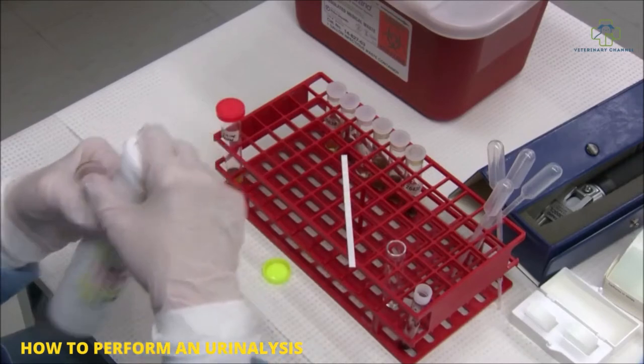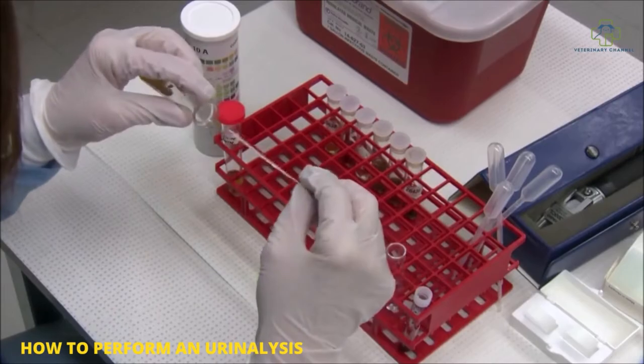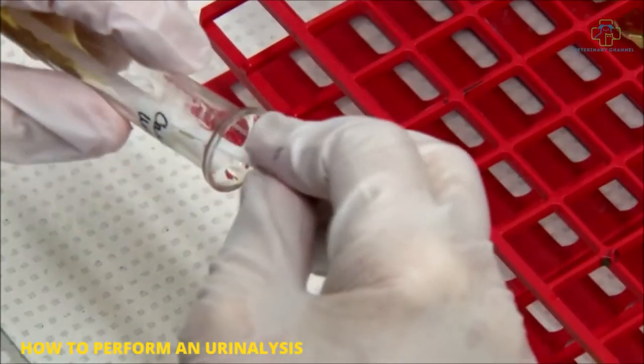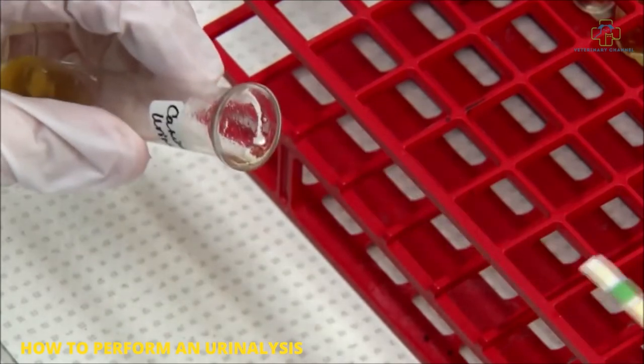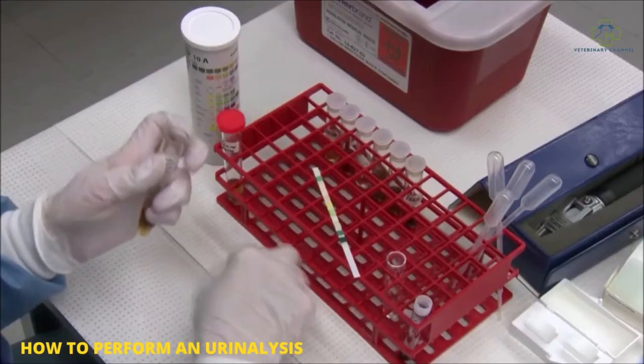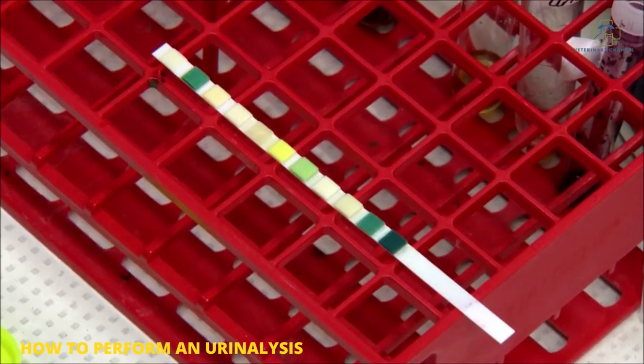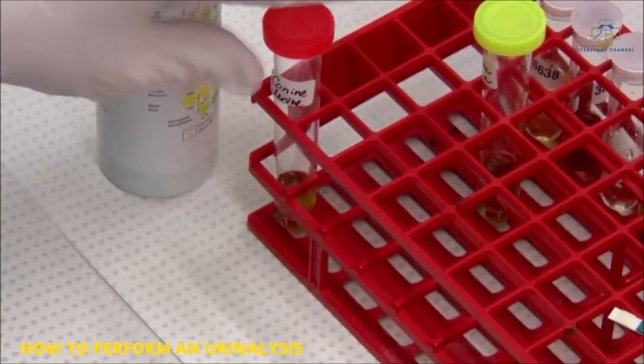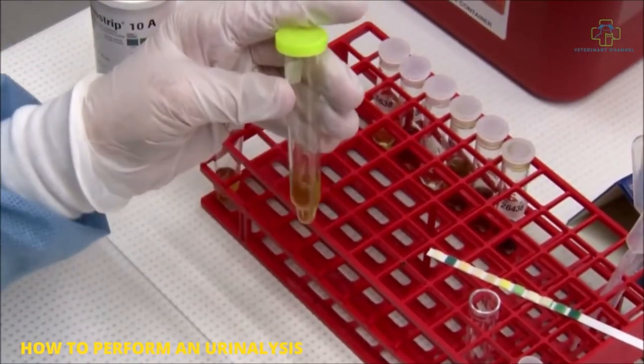Tip your urine forward, let it run up the length of the strip, and tilt it back. It's a quick one second dip. Then you want to let your strip sit for 60 seconds, and after 60 seconds you can read all of your results. When you're doing your urinalysis, you want to note your color and clarity.